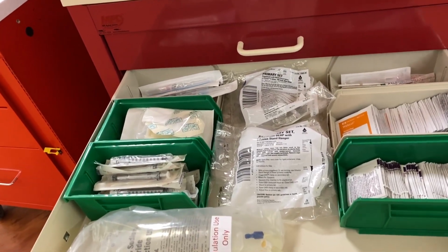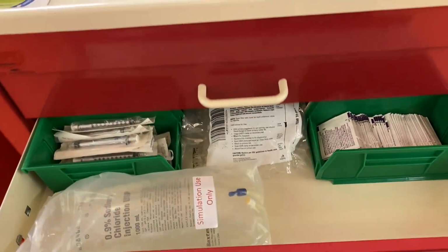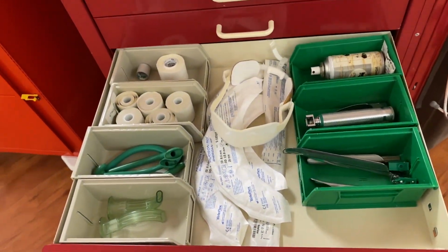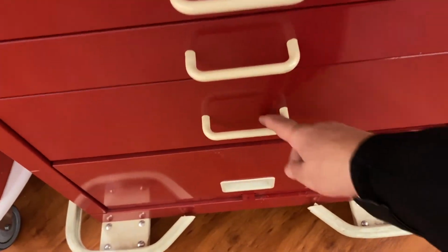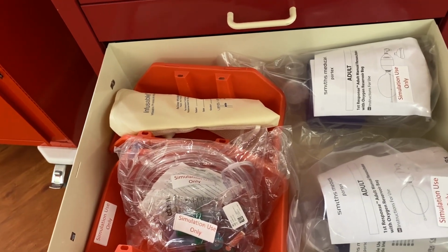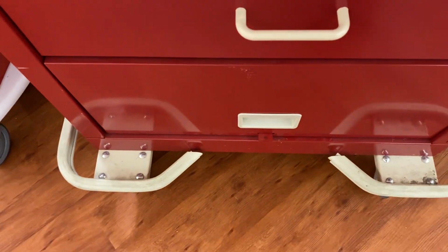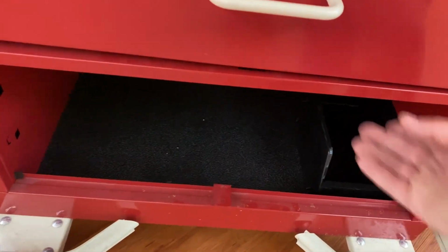You can see the various drawers here. This is all the syringes and IV start kits and saline and so forth. Respiratory supplies there. Ambu bags, oxygen tubing and so forth. Nothing in the bottom drawer.